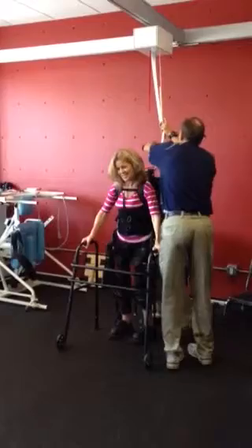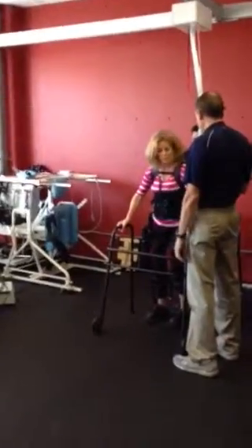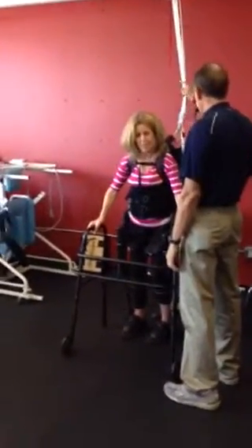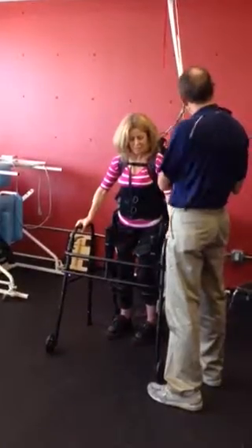I feel like I'm going to go forward. I've got you. You can't go forward. See? I've got you. You can't go forward. I don't want to pull you back too much because I'm going to mess it up. My leg is going first — the right leg is first. So you're going to lean to your left.